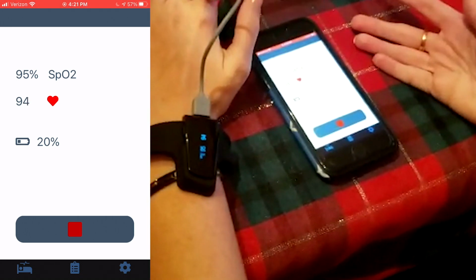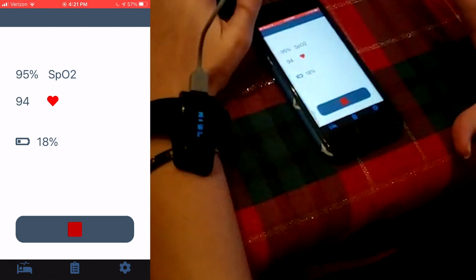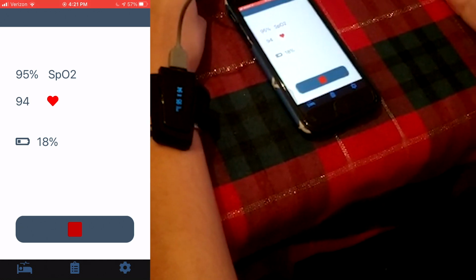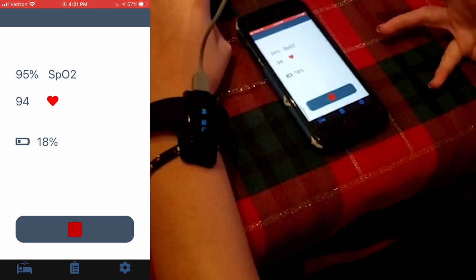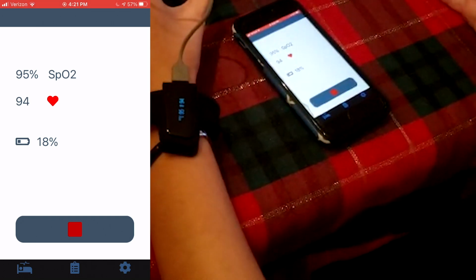So you'd be fine to shut your iPhone, iPod, or iPad off and leave it in the same room where you're sleeping. For instance, I left mine in the corner of my bedroom while I tested this out, and it recorded my data fine all night. And once it's recording, you're fine basically to leave it for the entirety of your sleep.